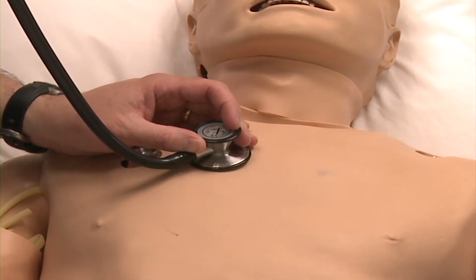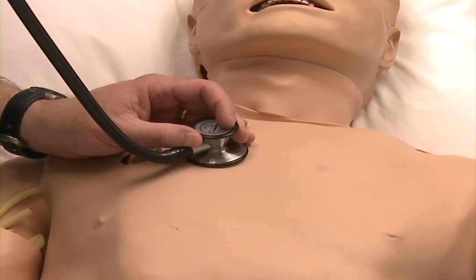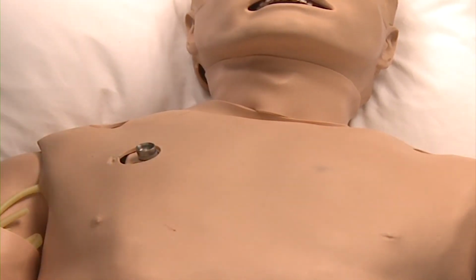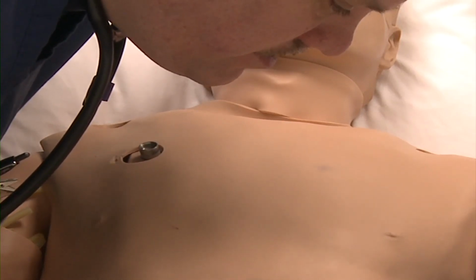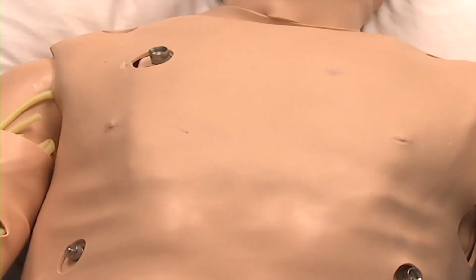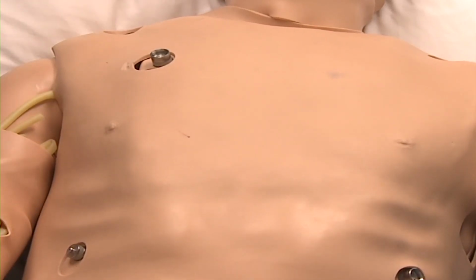As you auscultate and examine the chest, you'll no doubt notice and hear that the chest makes noise as the patient breathes. If we watch carefully and listen, we'll notice that there's a squeaking or rubbing noise each time the chest rises and falls. So that's the sound of the mechanical parts moving and rubbing together inside SimMan's chest. We do our very best to try to alleviate those sounds prior to you interacting with the mannequin, but there are sounds that are unavoidable.